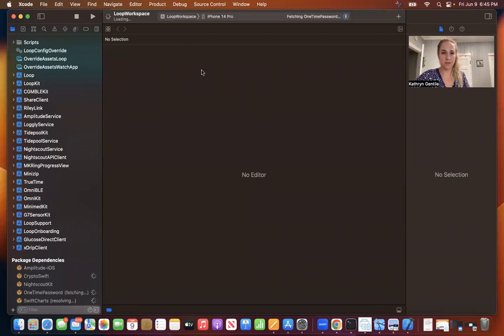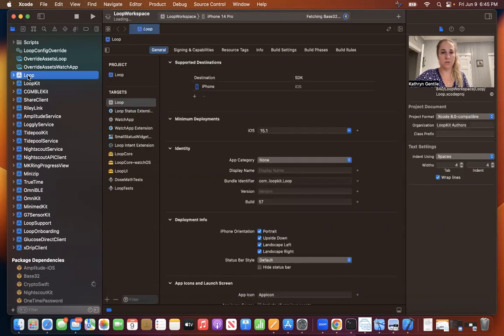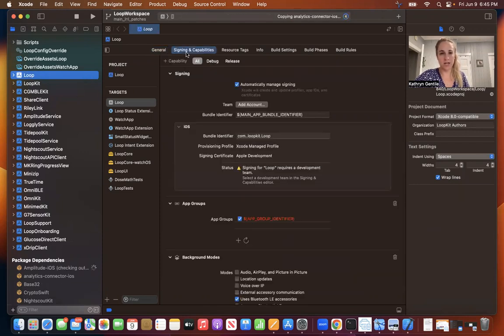Alrighty, just give this a second to load. Now, if for whatever reason you said that you didn't want to sign automatically, like I did, then you're gonna click loop here, go over to signing and capabilities, and you're gonna log into your Apple ID to add your team account there. Another thing you're gonna have to do in here is register your device. So if your device isn't registered, a pop-up thing will just come up and say that you need to register it if you press the play button and you start to build. So not a big concern, but make sure all's good here.